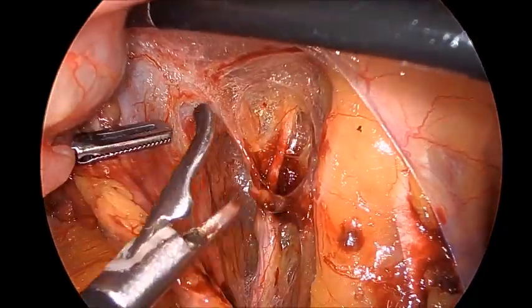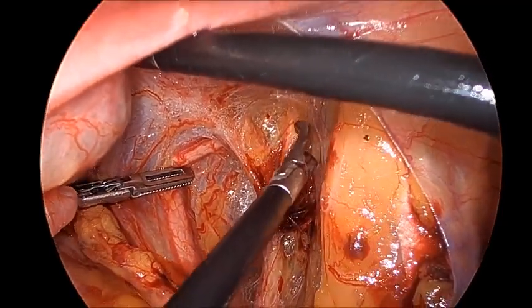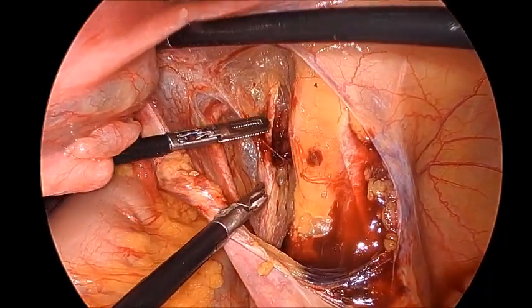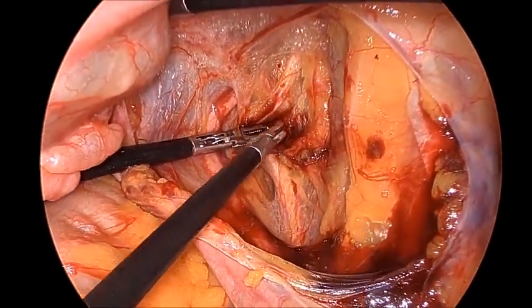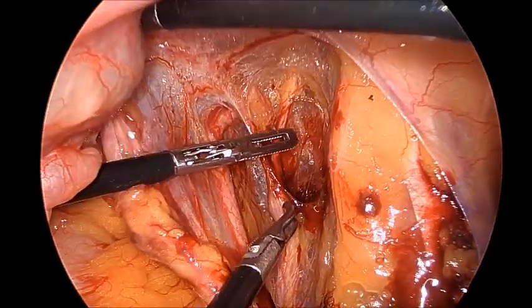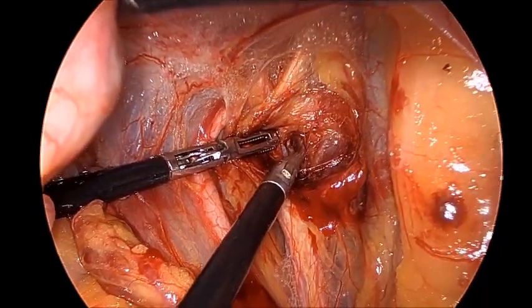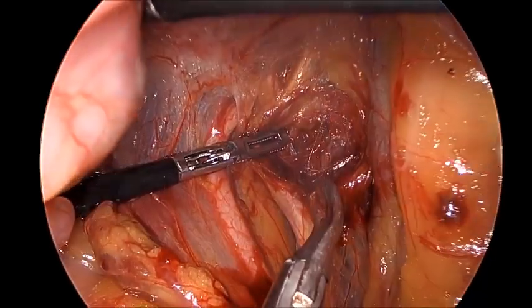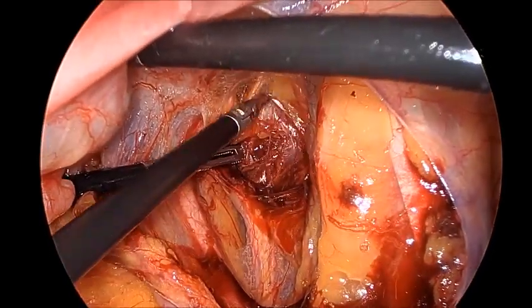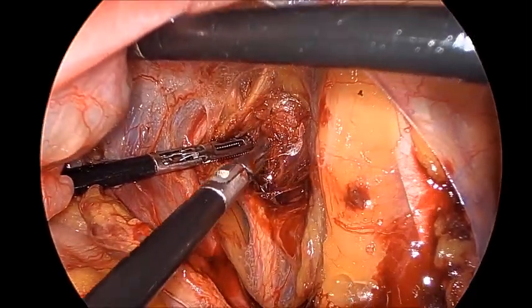Remember, this helps in acute control of bleeding, but the vascularity of the tissue is maintained by collateral formation later on in the body. So there is no long-term damage by doing this procedure. We can do this retroperitoneal dissection and ligation, coagulation of the uterine artery at its origin routinely before any complex hysterectomies, because that is going to reduce a significant amount of bleeding during the procedure.